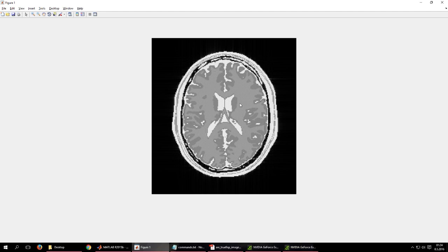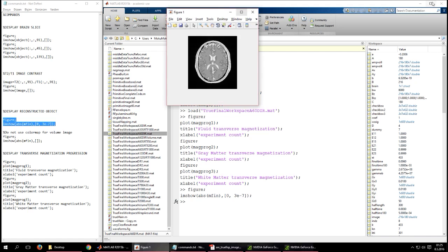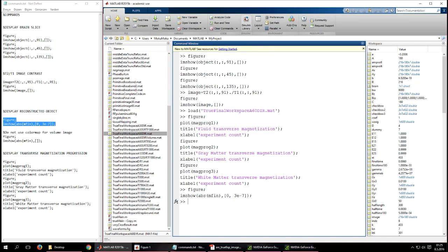The Gibbs ringing artifact due to truncation is visible in the image. There is another artifact in this image, which I believe is not apparent in the video recording: a very weak blurry shift in both horizontal and vertical directions. It will be more visible in one of the next simulations, so I will talk about it later.